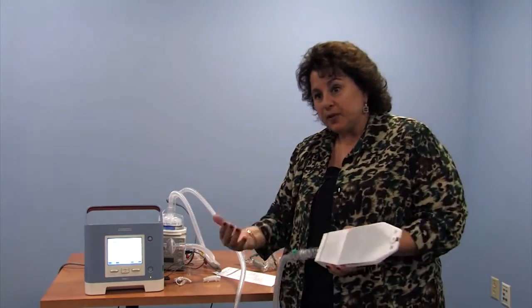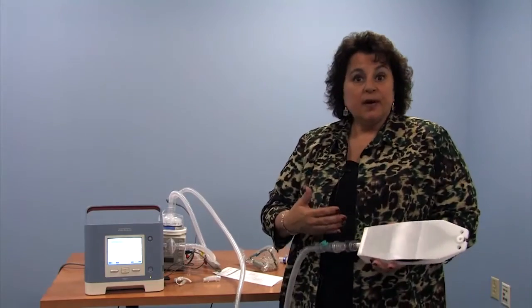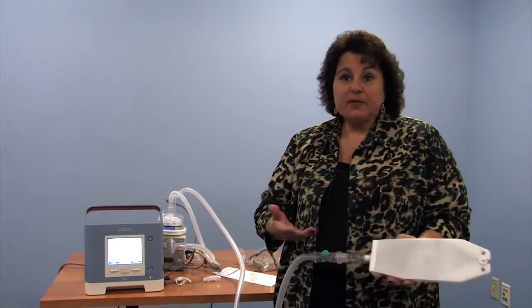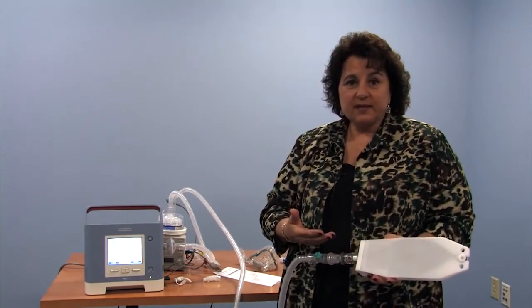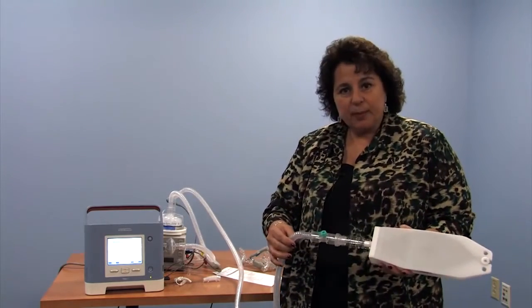So we're going to implement the Trilogy. And we can do this without changing the tracheostomy tube. The family may be very comfortable with the tracheostomy tube that they have in place and don't want to add a cuff to that. So this gives us that option as well.